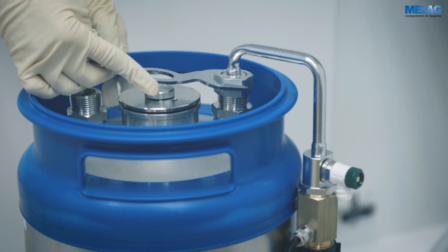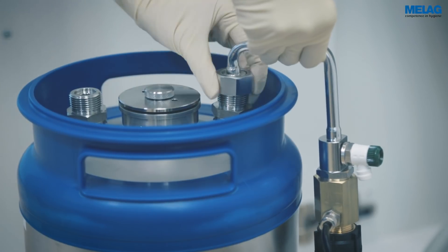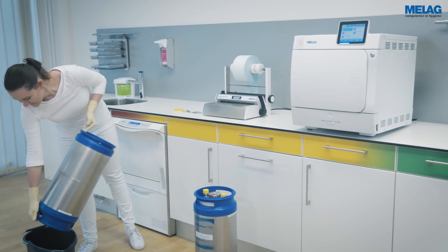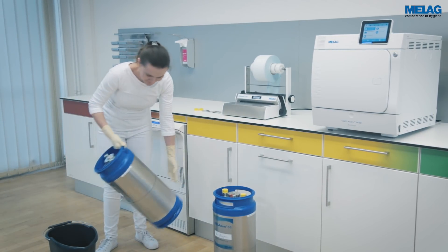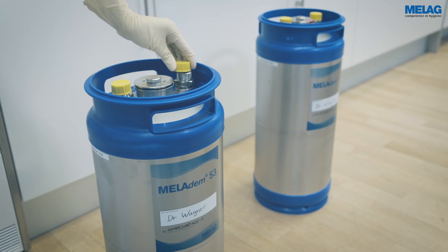Remove the connecting bend using the open-end wrench included in the scope of delivery and place the cartridge upside down in a small bucket to empty it completely. Screw on the yellow sealing caps on the connection fittings before packing the mixed bed resin cartridge in the Miele transport packaging.